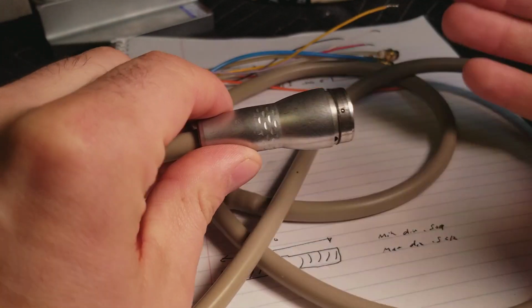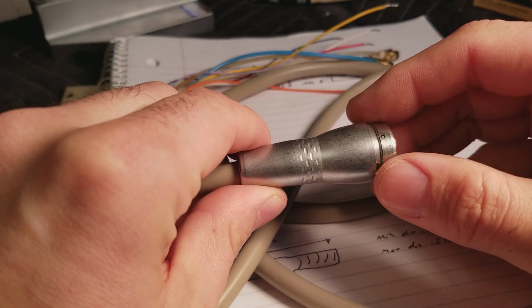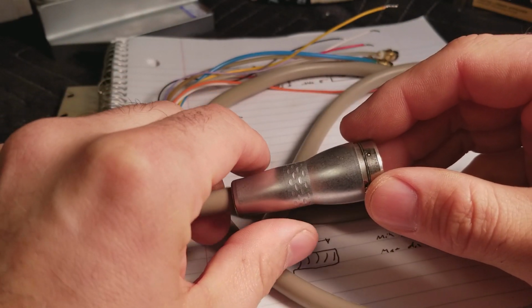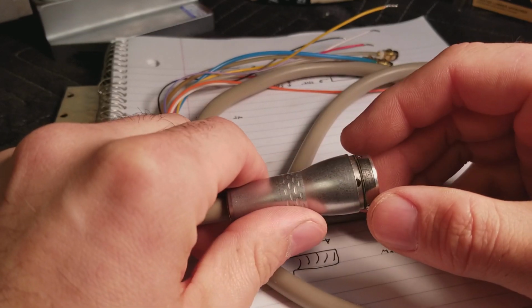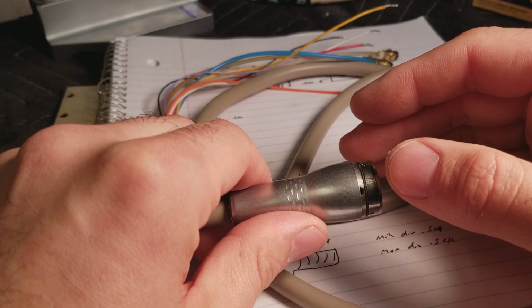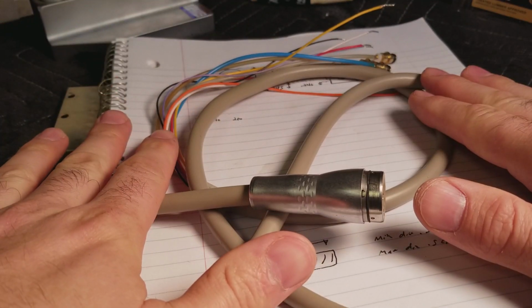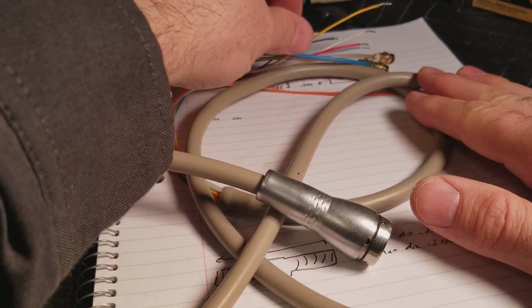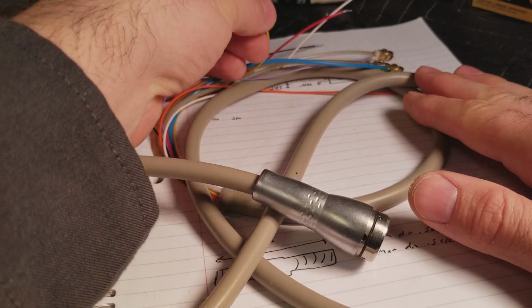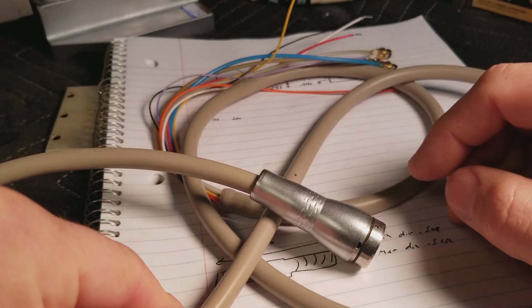So what basically happened with me is the electric motor quit running, but the light and everything else was working. So I at first thought it was the actual control in the delivery unit, but upon further inspection, found out it's actually in this cable here. What happens is oftentimes one of these electric wires breaks inside the silicone tubing, thus rendering the motor control useless.